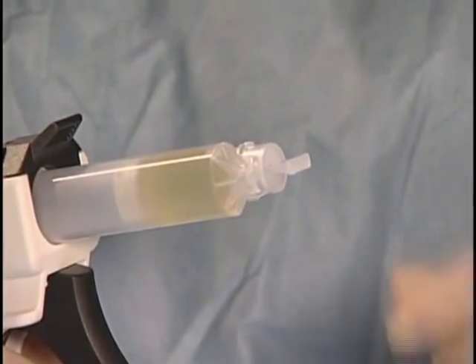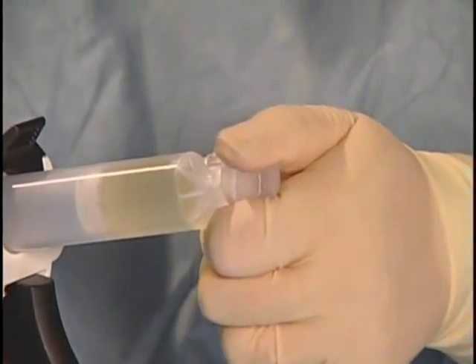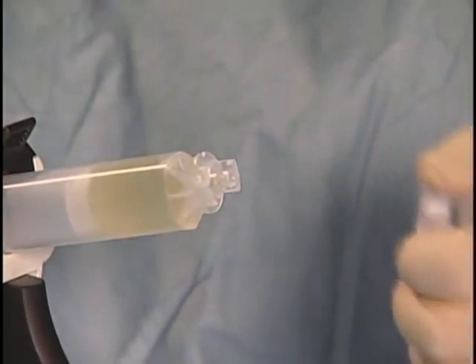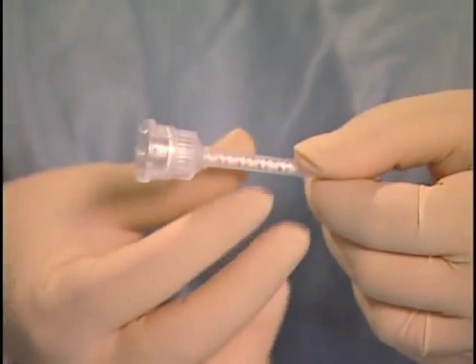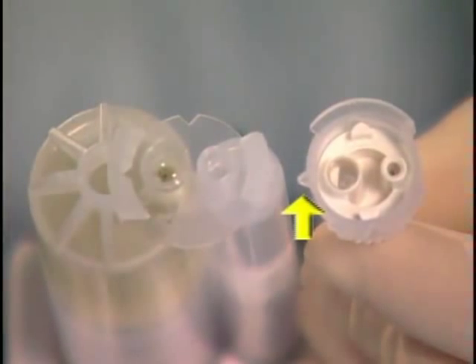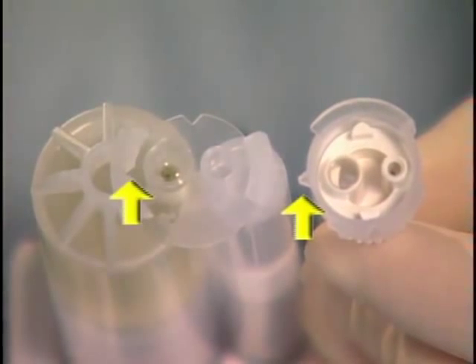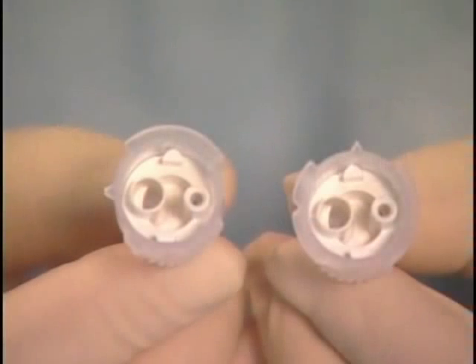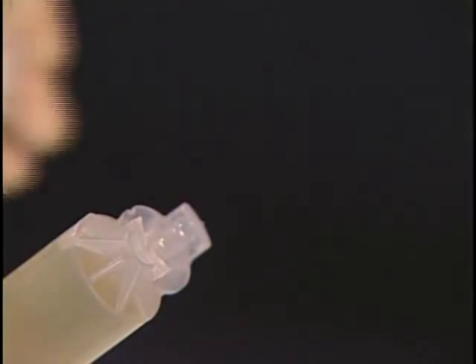With the nose of the solutions cartridge facing upward, turn the twist-off cap 90 degrees counter-clockwise and gently remove it from the solutions cartridge. Now you are ready to attach the applicator tip to the solutions cartridge. Take care to align the triangular notch on the collar of the applicator tip with the corresponding notch of the cartridge nose. This notch must be aligned with the large interface of the cartridge's nose to ensure proper attachment. Attach the applicator tip to the cartridge.